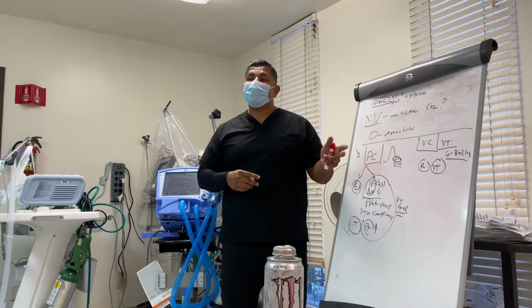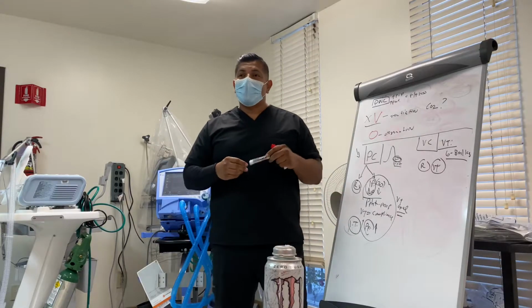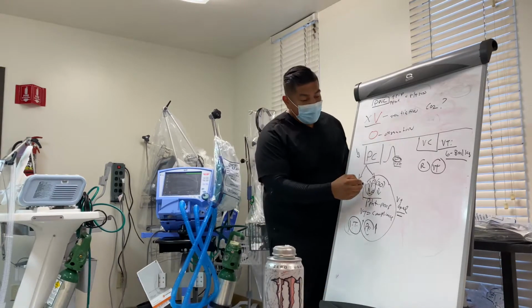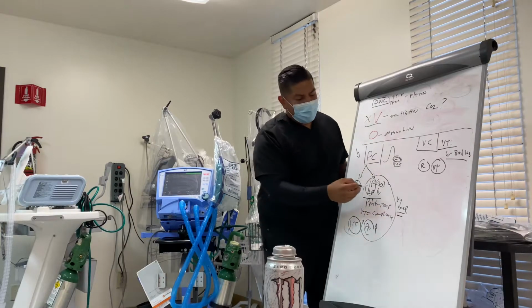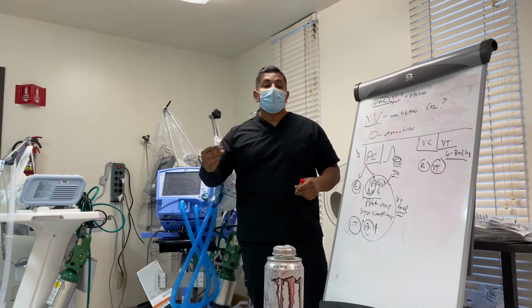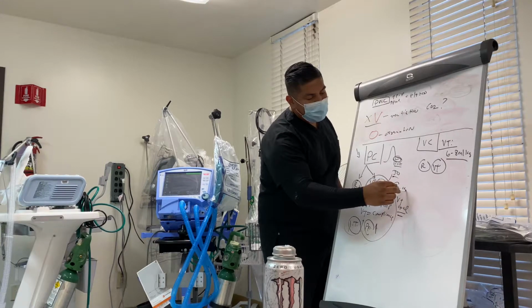Yeah, go ahead and adjust it. But be very careful, okay? What does Spider-Man say? With great power comes great responsibility. So when you are in charge of changing the inspiratory pressure and you're like, oh, I'm not getting anything, I'm gonna go from 30 to 50. Bro, come on, not there. You gotta adjust it 3 centimeters at a time max and see what you get.